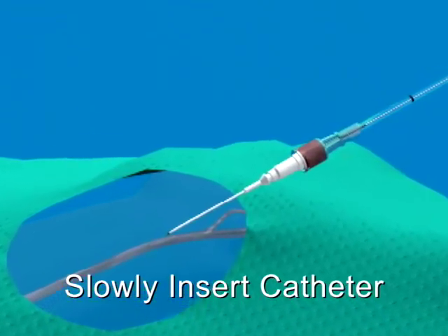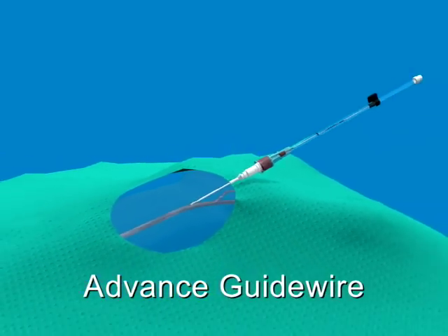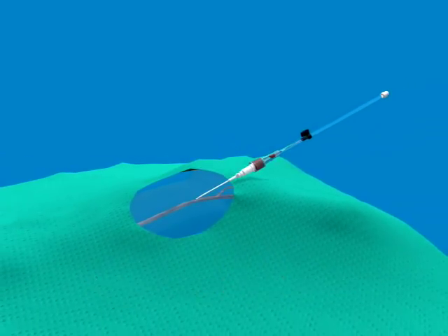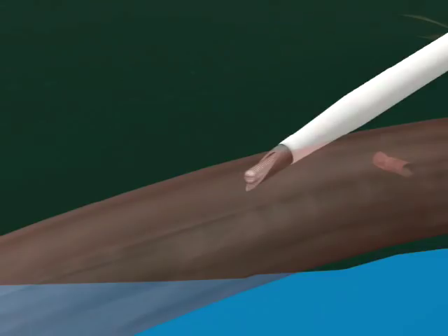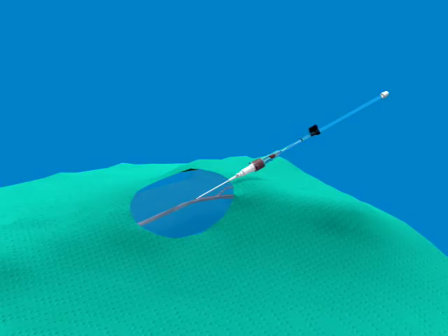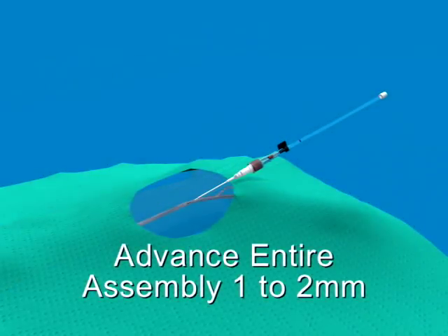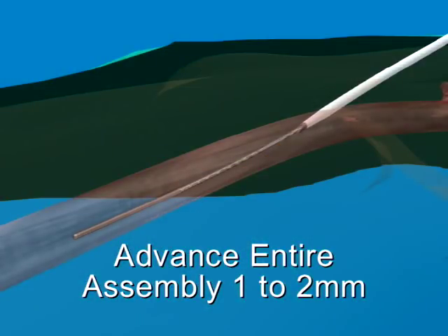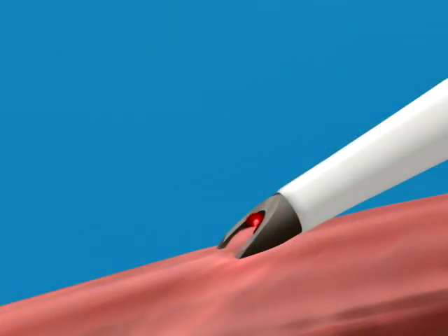Slowly puncture the vessel. Look for flashback in the flash chamber just behind the needle protection cap. Stabilize the needle position and advance the spring wire guide. When the handle reaches the black mark on the feed tube, the tip of the wire has reached the needle bevel. If you meet resistance at this time, the wire can be safely retracted and better positioning can be attempted. After advancing the wire and encountering no resistance, advance the entire unit one to two millimeters to ensure the catheter tip has entered the vessel. It is possible to see a blood return without the catheter being fully in the vessel, because the needle bevel may be in the vessel and the catheter tip, which is located just behind the needle bevel, may not have fully entered the vessel lumen.